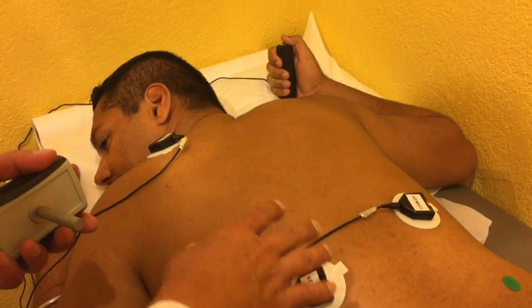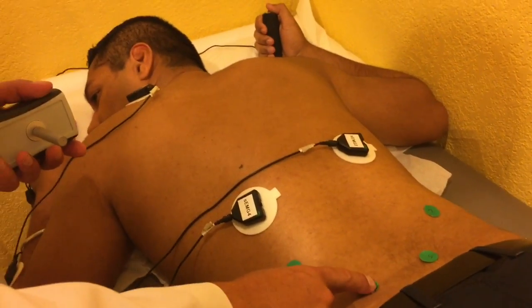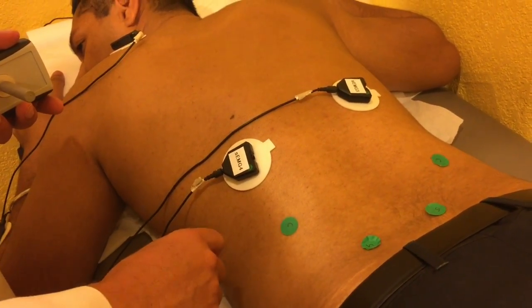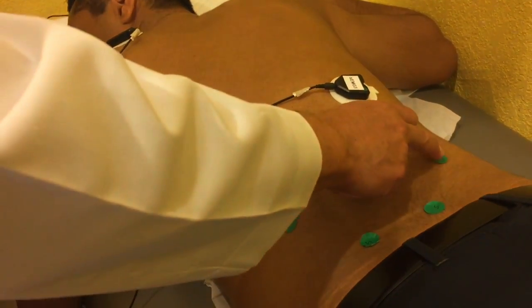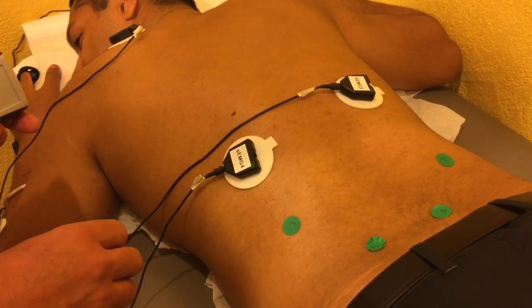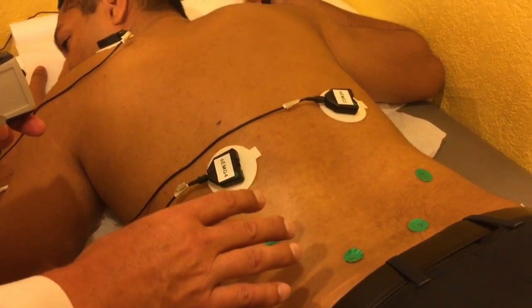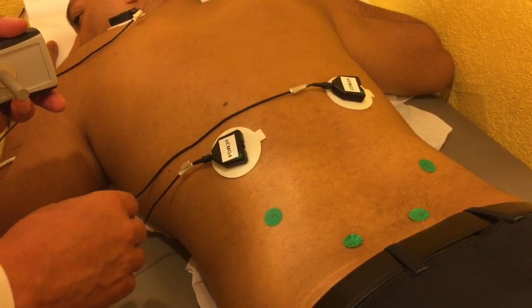When we do the test, we're going to test at each location 3 times. There will be 3 trials at the symptomatic site, 3 trials at the control site, 3 trials at the symptomatic site on the right, and 3 trials at the control site on the right. Once patient data is entered into a computer, you'll start the test. The test will prompt you on what to do. We will go ahead and proceed with testing.